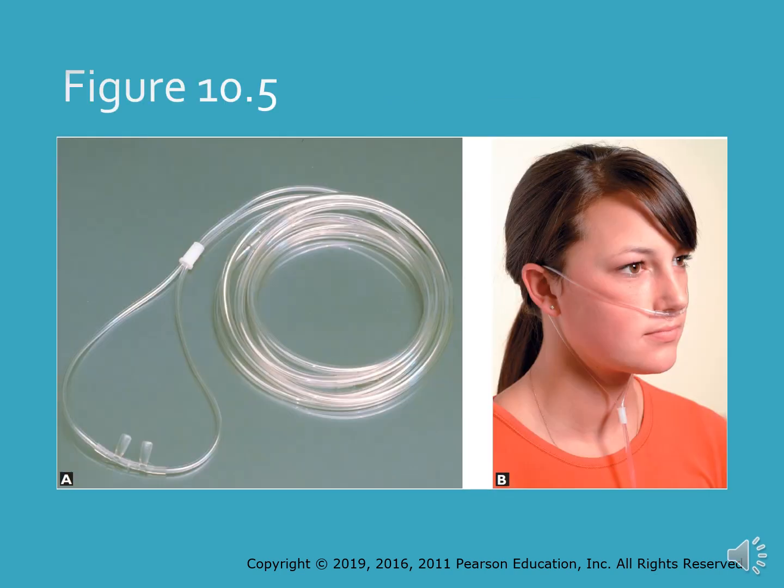In picture A is an example of an adult nasal cannula, and in picture B is a nasal cannula properly placed on the face of that patient.